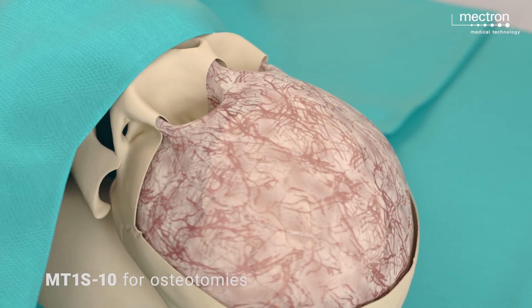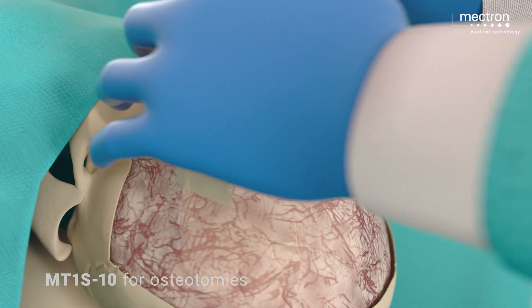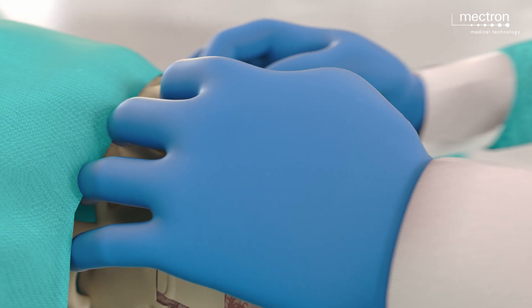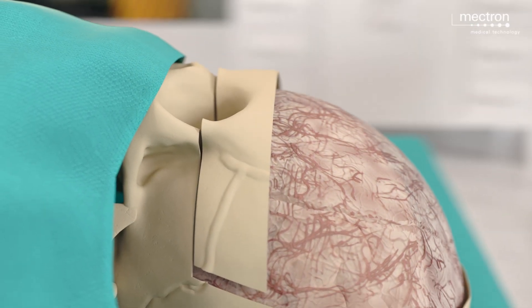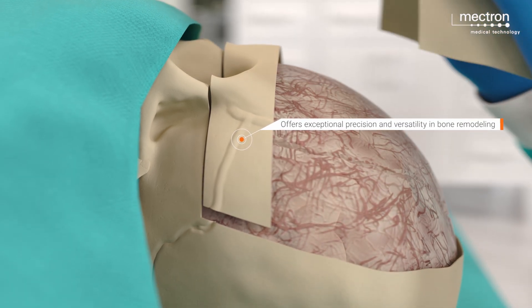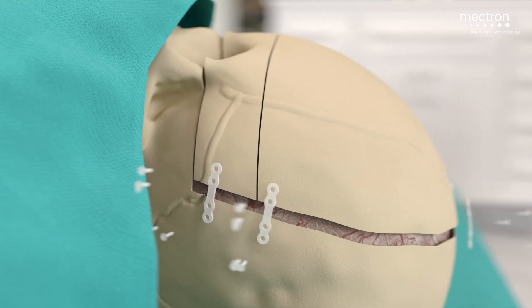The orbital bandeau is repositioned 1 cm forward in both temporal regions and secured in its new position using resorbable plates and screws. The frontal bone is reshaped using relief bone cuts made with piezo surgery and secured to the orbital bandeau in its new position with resorbable sutures.